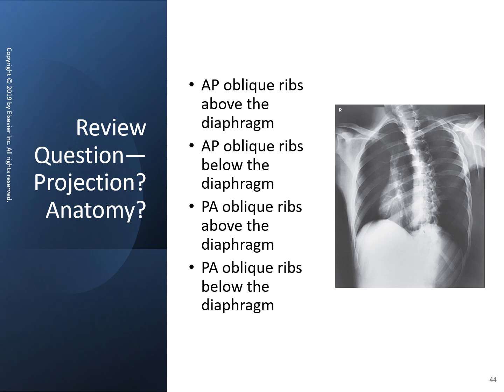Okay. They've opened the collimation to include the left side, but the area of interest is the right axillary rib cage for this projection. And I'll show you how that manifests. You see how the left ribs are self-superimposed, the anterior aspect and the posterior aspect? You have to look close, but it's there. Whereas the right ribs, you can barely see the anterior aspect. They're rolled out of the way, the oblique. If only we could remove that heart shadow, and then we'd have a really good view.